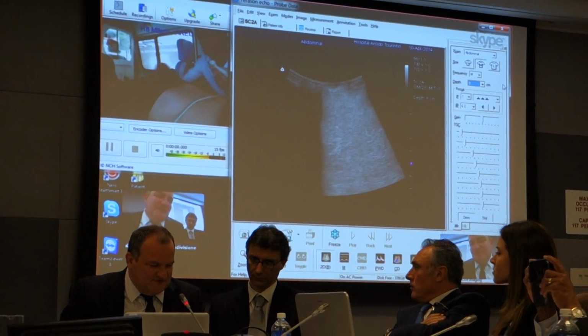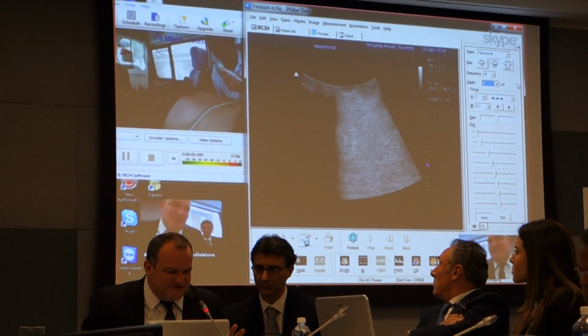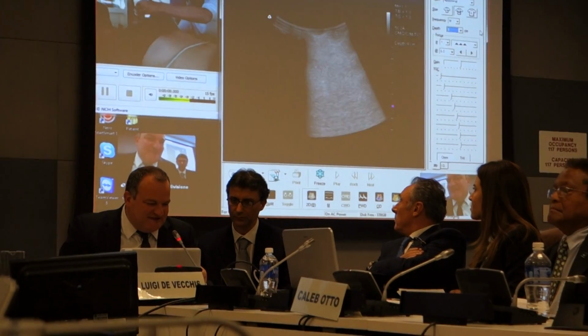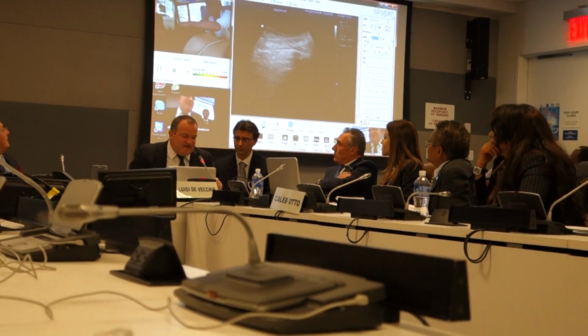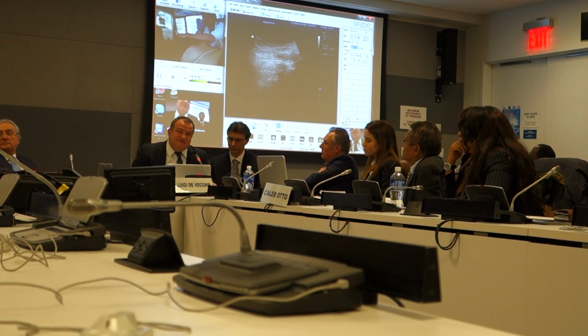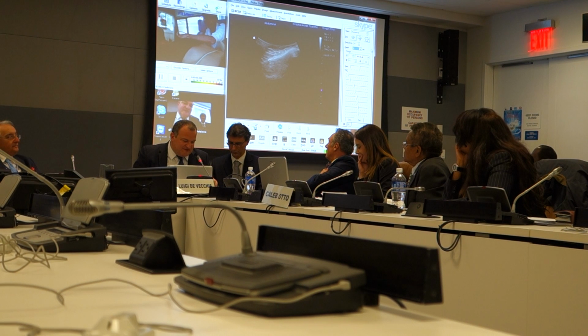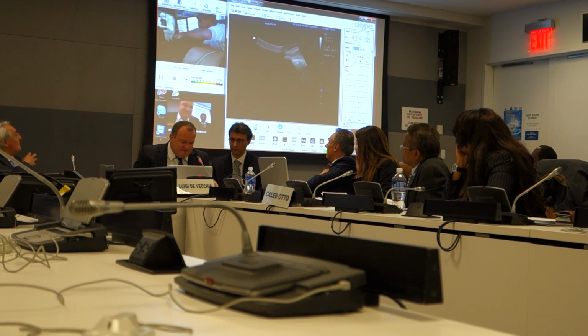We trained you to just detect basic pictures in our last course, but I know that you're not so skilled. You have to decide whether to go to the local hospital that has no surgical facility, or to move to the very far hospital of Montesclaro, 200 kilometers from there. So just show me first on the thorax if there is something wrong.